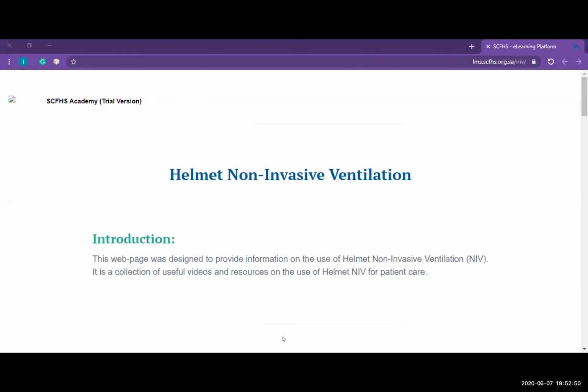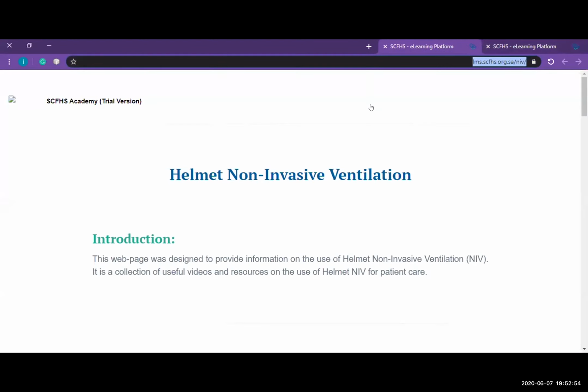One question is, why are we using the ramp when we set up the ventilator? Well, the ramp or the rise time or the speed is very important for patient comfort. This will decrease the work of breathing. So, as we said, we like to set it as fast as you can.